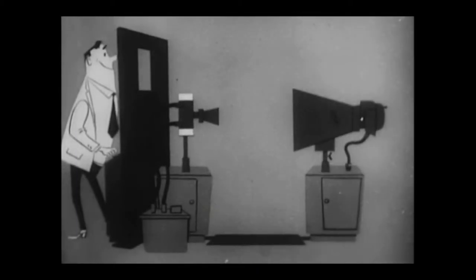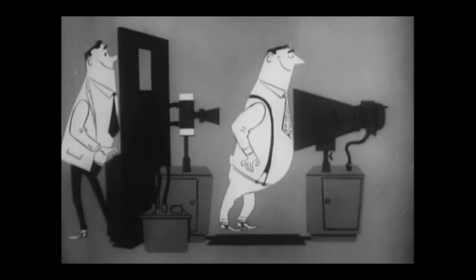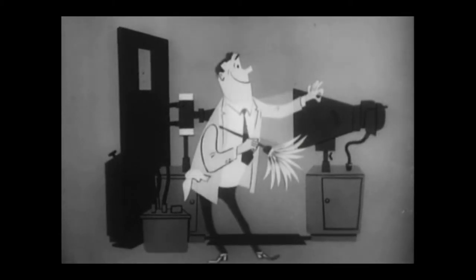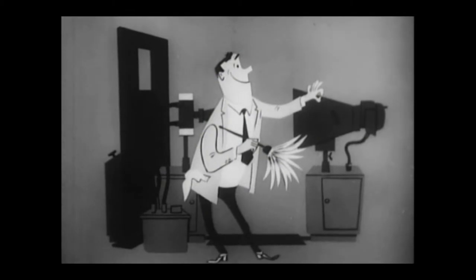Yes, Ike's a first class operator and a valuable guy to have around in x-ray work. He knows his equipment cold. He knows what it can do and what it can't do. He's never burned out a tube before its time or shorted out a power line ever since he's been doing x-ray work.